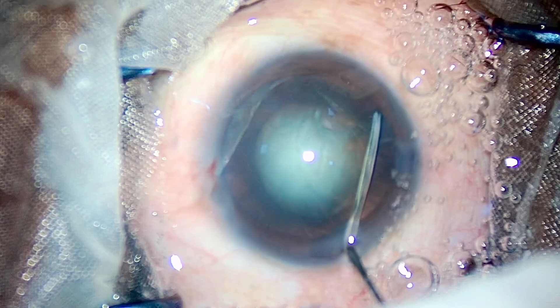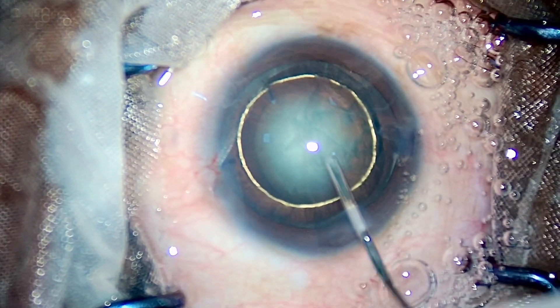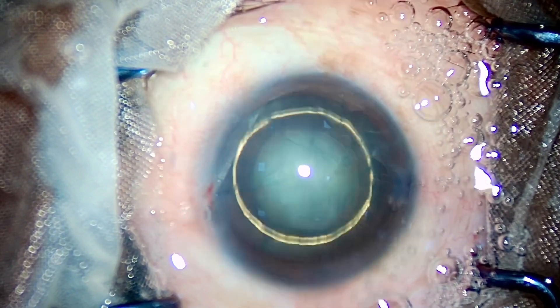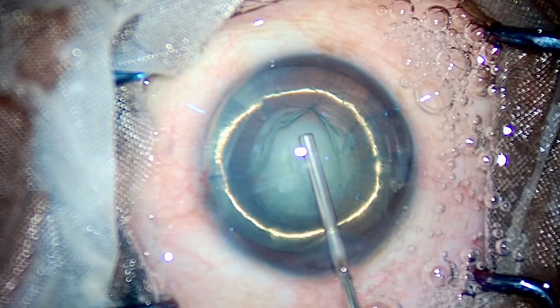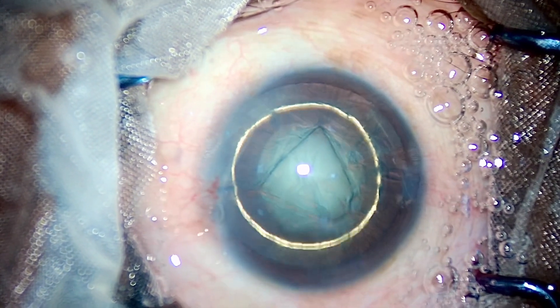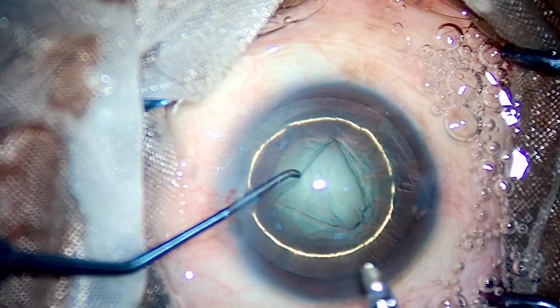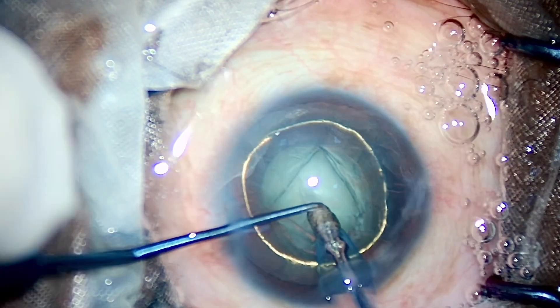Cases like these come along in your career and they just make you smile. As you can see, I have hydrodissected the nucleus and made a really nice hydrodelineating wave, causing the characteristic bright golden ring sign that you see here. It's a beautiful golden ring sign. The cortex of this nucleus is soft and the nucleus is around grade two or grade three.